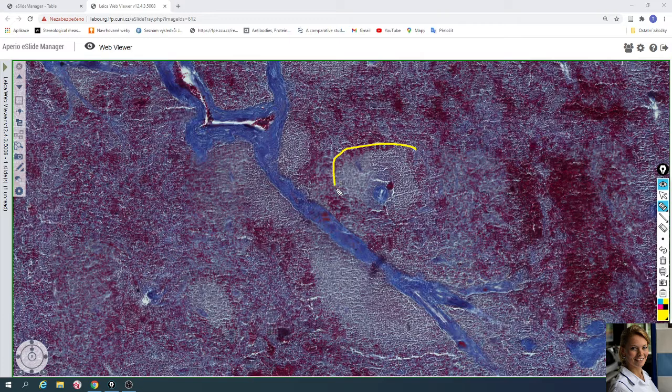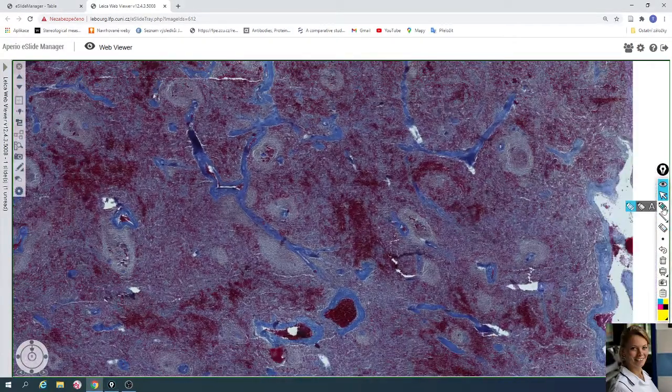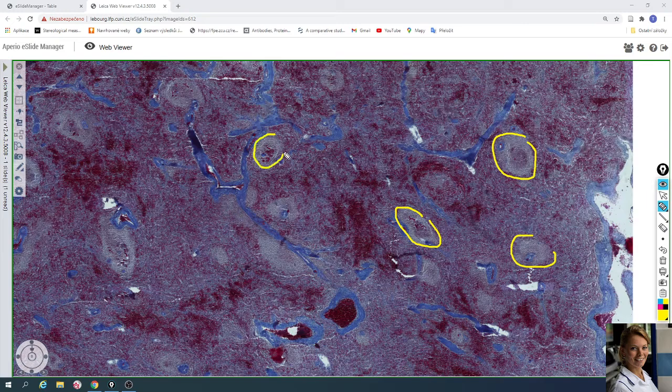This is a lymphatic follicle from the white pulp. This is another lymphatic follicle, or Malpighian body of the spleen, which forms the white pulp of the spleen. So, the summary: the lymphatic follicles are the white pulp of the spleen.